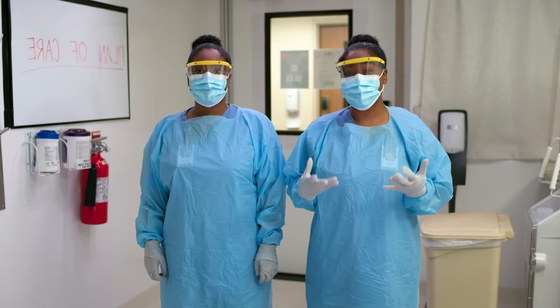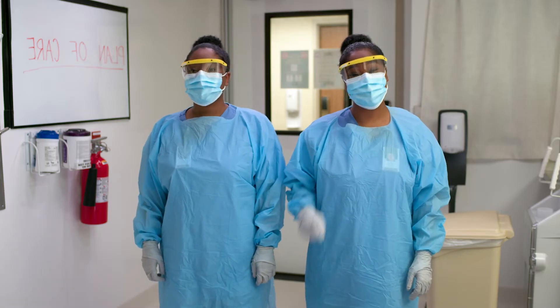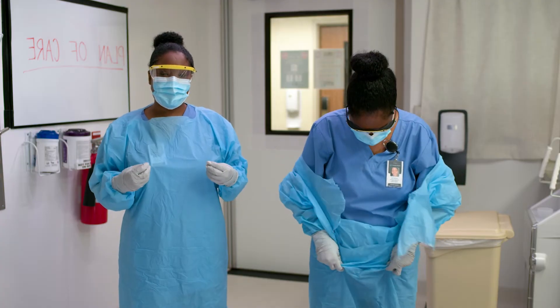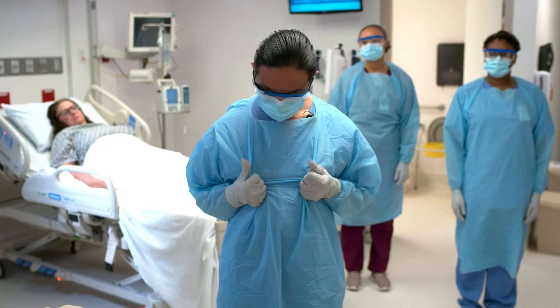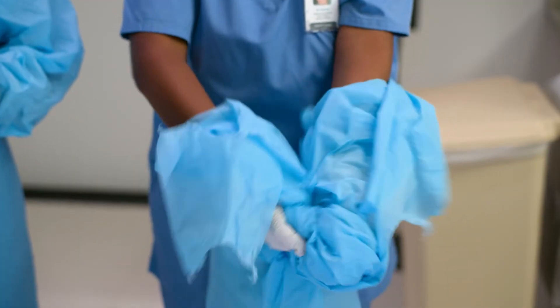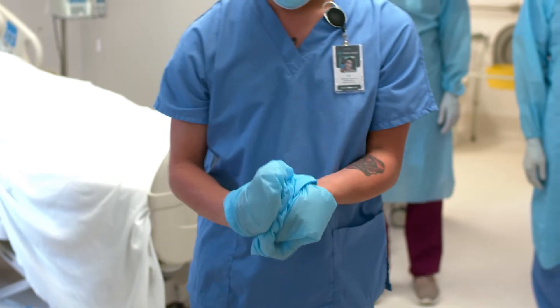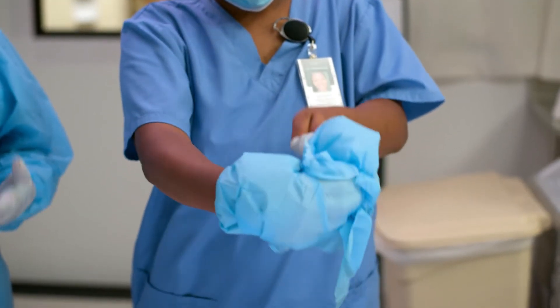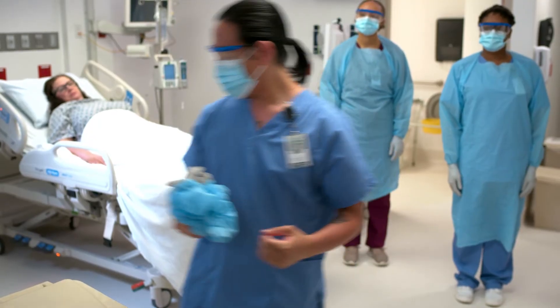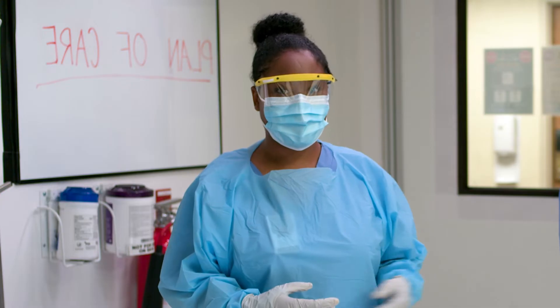First, remove gown and gloves. Here is one of the recommended best practices for doffing gown and gloves — it's the one-step method. First, grasp the gown at the front and pull away from your body to tear the ties at the neck. Then grasp it again a little lower to tear the ties at the back. Make sure to keep your hands on the outside of the gown. While removing the gown, fold or roll the gown inside out, away from the body, and into a bundle. As you are removing the gown, peel off your gloves at the same time by first releasing one hand and then the other. Place the gown and gloves into a waste container. Try not to touch the contaminated areas with ungloved hands while removing PPE.